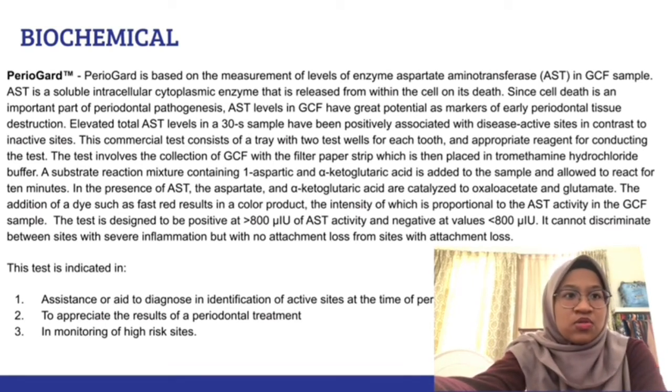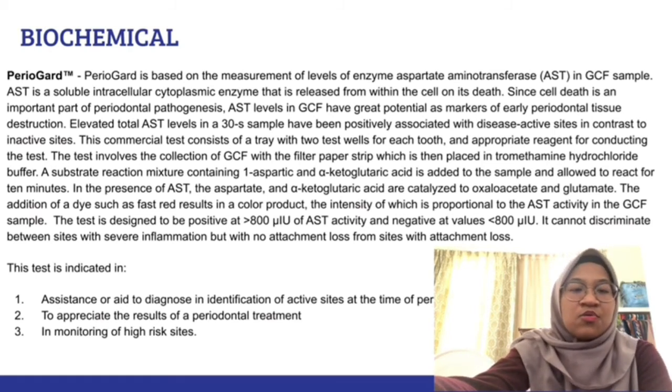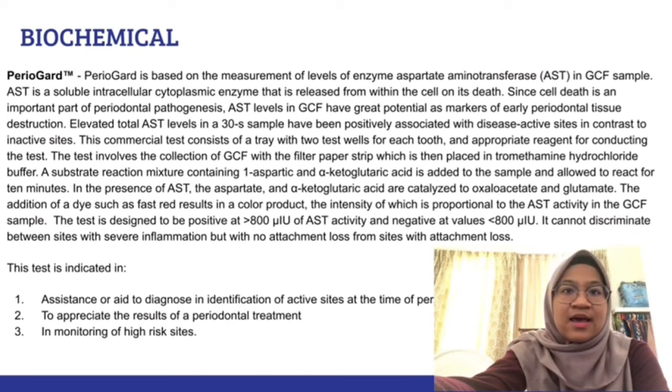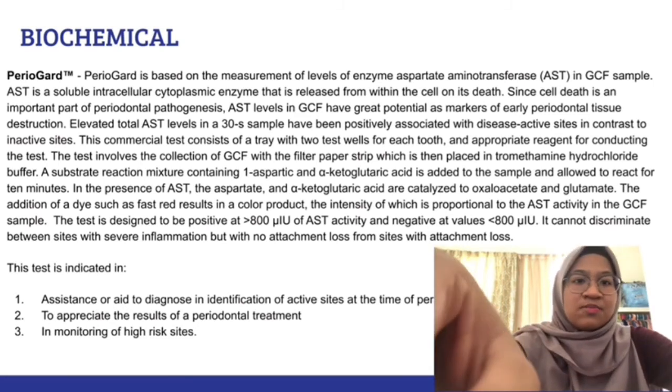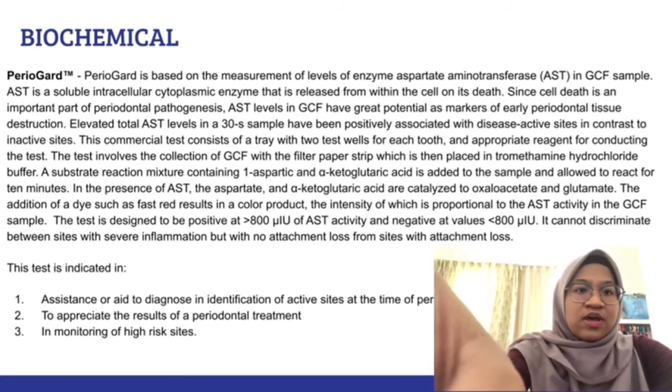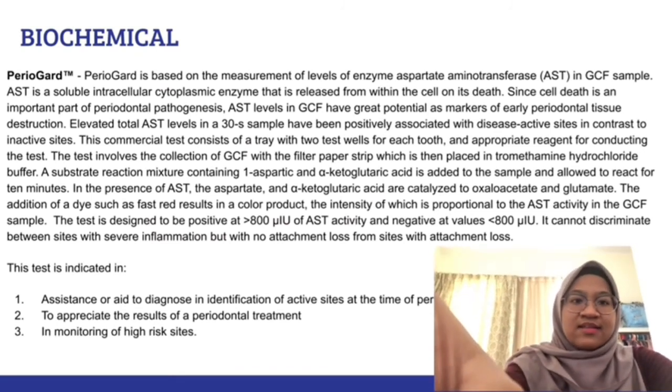This test is also indicated as an aid in diagnosis, in identification of active sites at the time of the periodontal disease. It also helps to appreciate the result of the periodontal treatment. It also aids in monitoring of high risk sites.